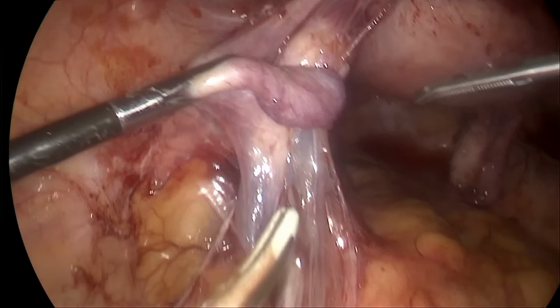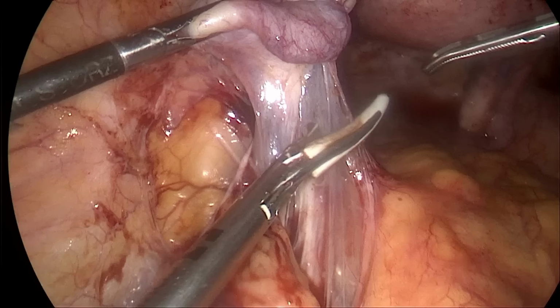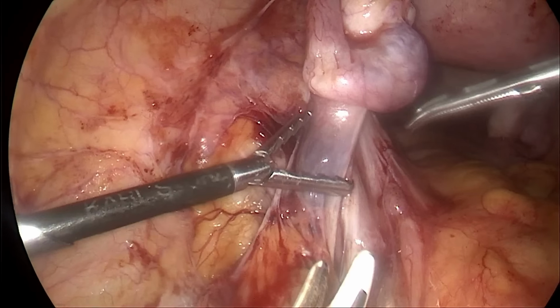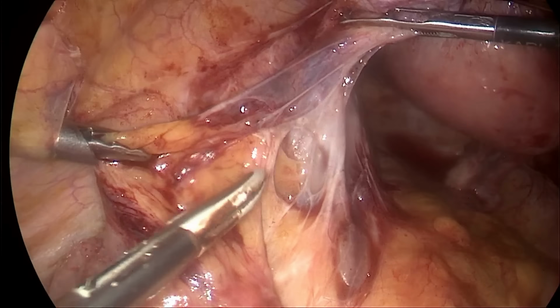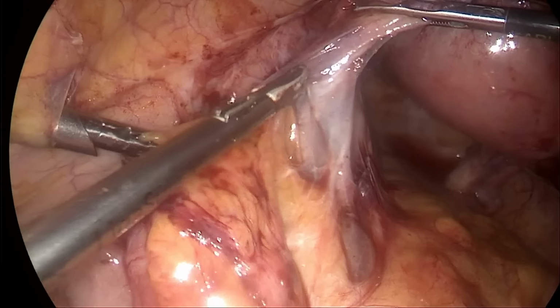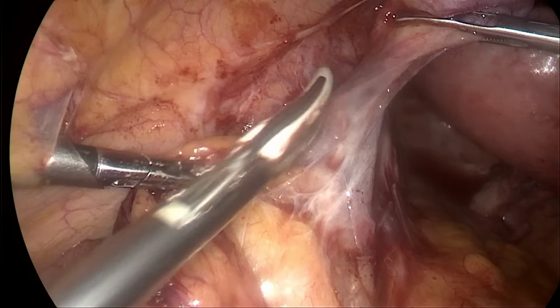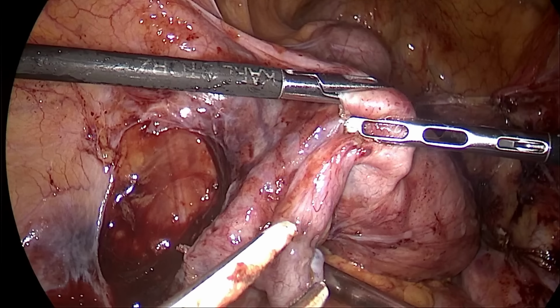Some flimsy adhesions are also released. Last part of the bowel that is adherent with the left-sided IP ligament. I'm trying to release that so that we can skeletonize the IP ligament and also enter the retroperitoneum.